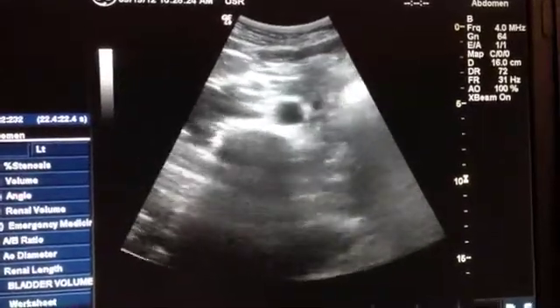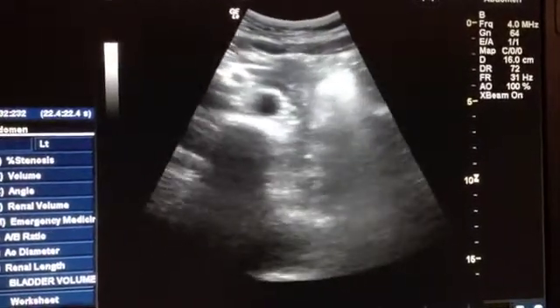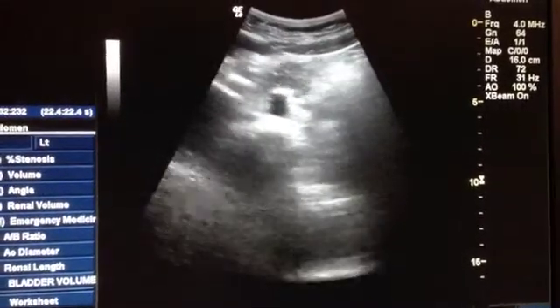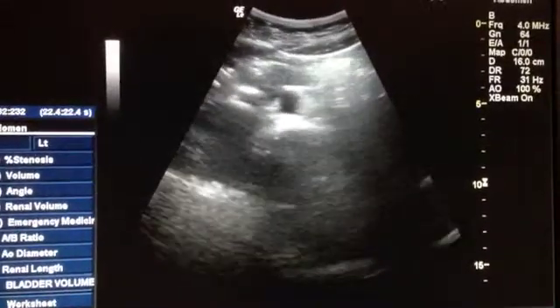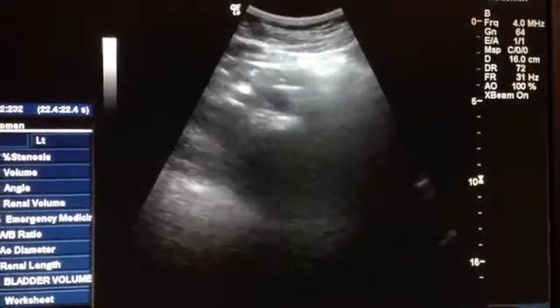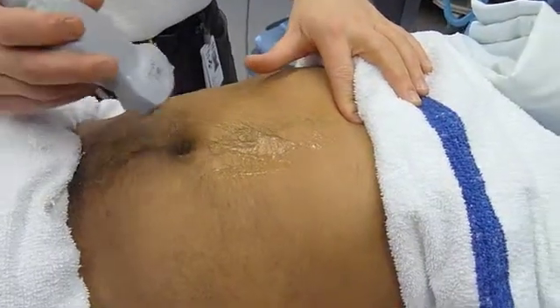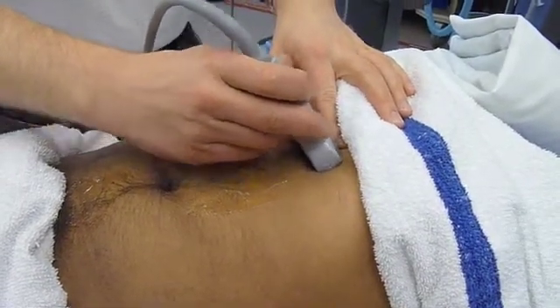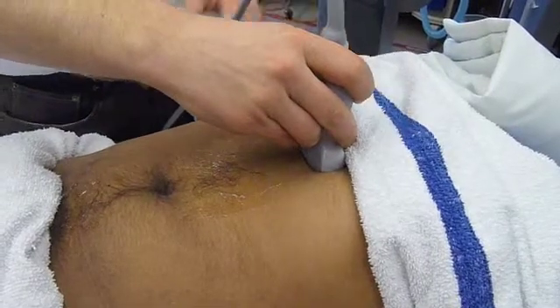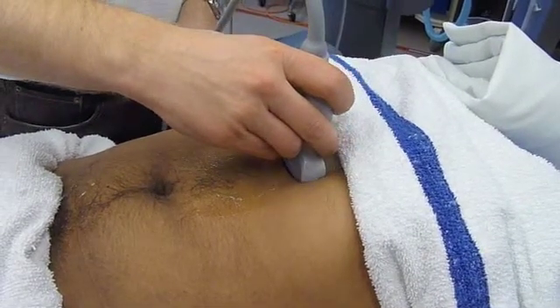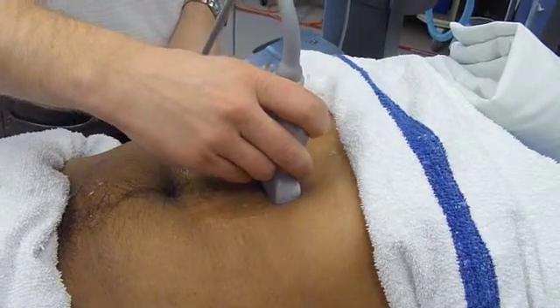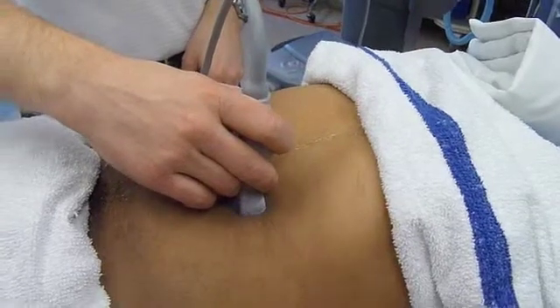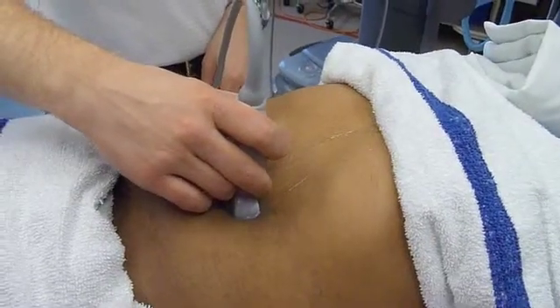Here's what it looks like on the screen — we move the probe laterally, we can still see the aorta, and then I rock the probe so we're still looking at it but now from an angle. Let's start again and do the whole scan: find the xiphoid, bring the probe up to perpendicular, and slide down following the aorta. Make sure you keep the probe in the same position all the time. Nice scan!